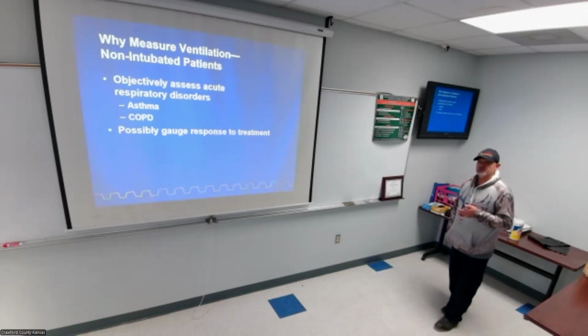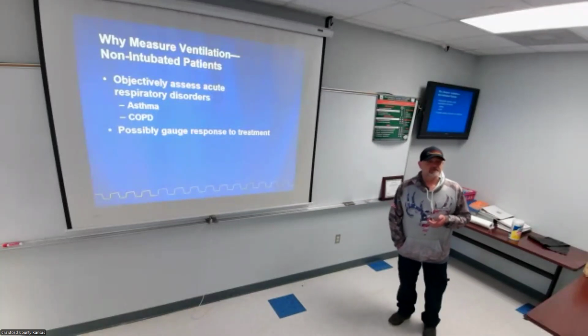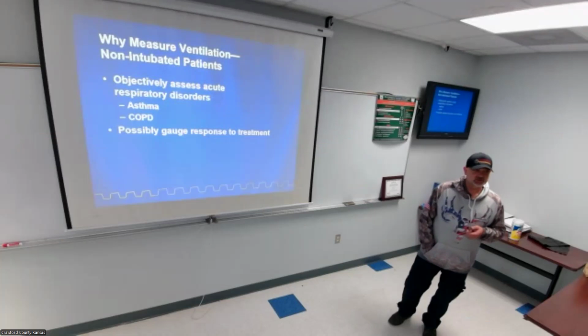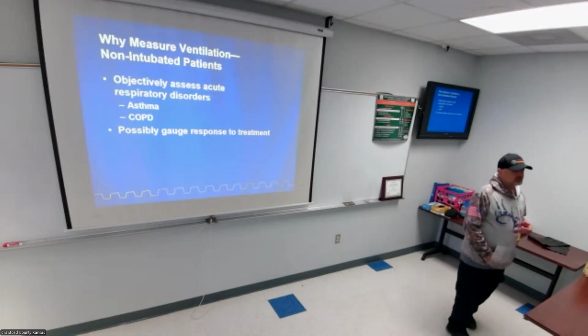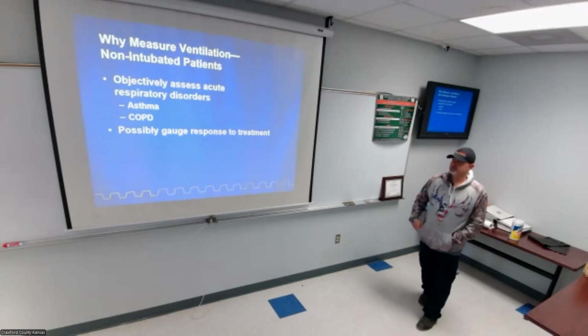Anywhere from, anybody know the gold number to intubate your patient with your CO2? 70. If you have an end-tidal CO2 of 70, any ER in the nation should intubate that patient immediately, because medicine at that point is pretty much not effective with them.